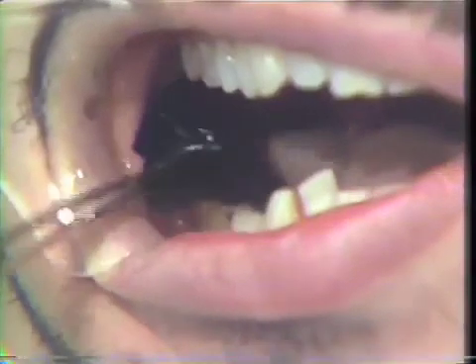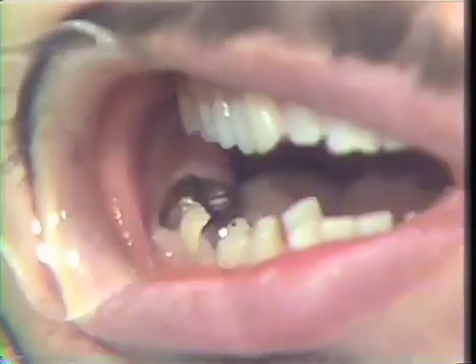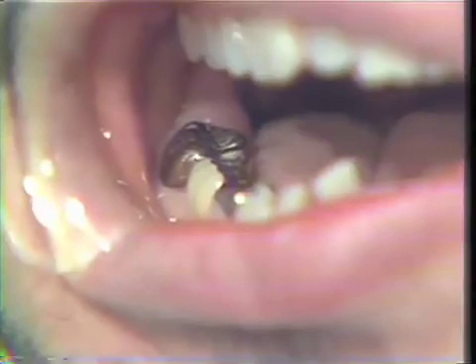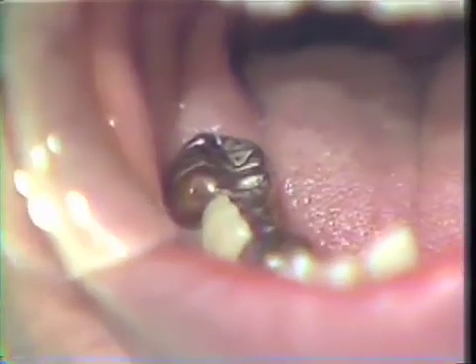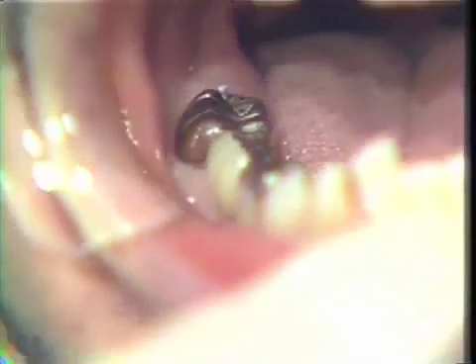Now check it in the opposite excursion. Back together again, please, and slide towards me, please. Fine. Open, please. And I see no balancing contacts on the dentition. And back together once again, please. Right straight forward, please. Fine. Open, please. Good. And we have no interference in our protrusive excursion. So we would make those few refinements.